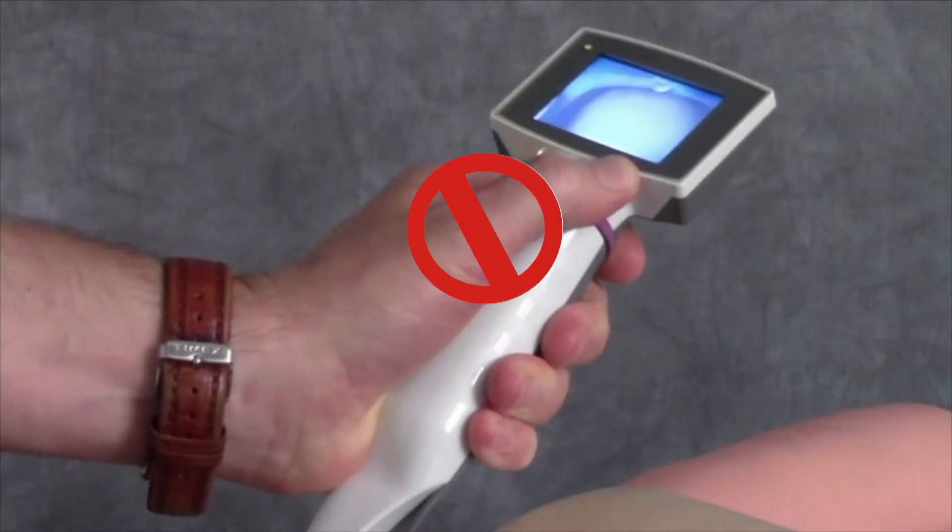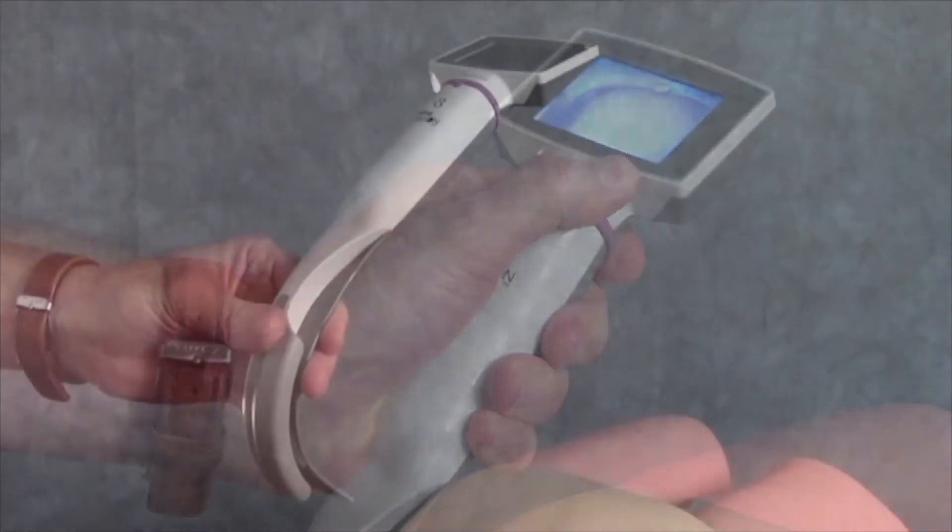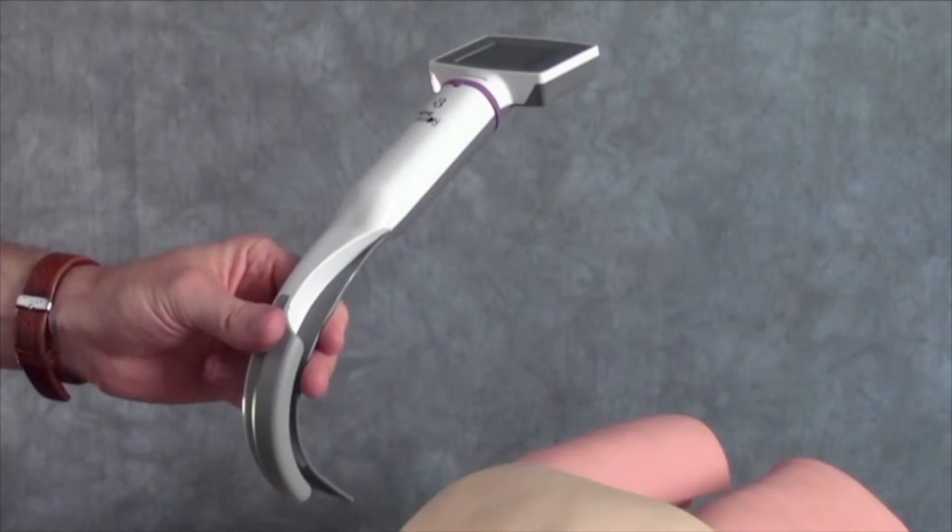Next, do not hold the laryngoscope by the handle. I realize that's what they put it there for, but take my word for it — hold it low and light. Hold it with just three fingers. Put your thumb where the channel comes out from the blade, where the color changes. Hold it very low, very light, and that will set you up for success. It will help prevent you from going too deep with the intubation attempt.